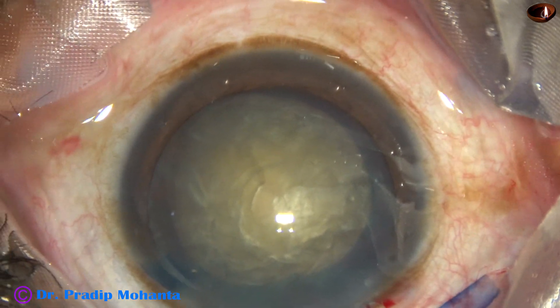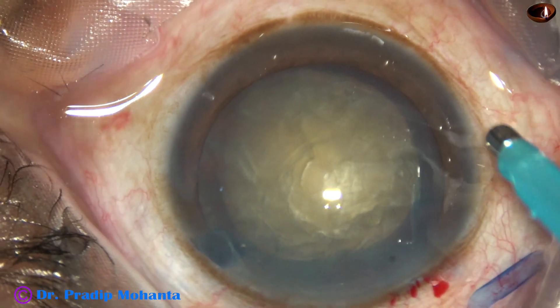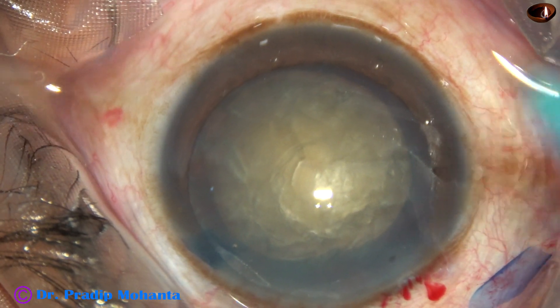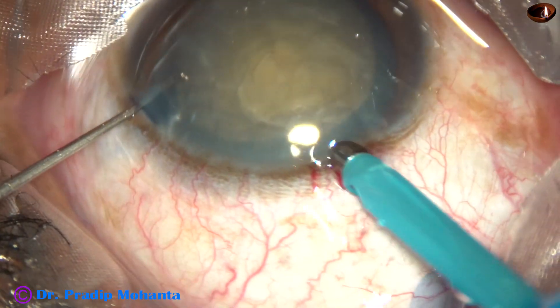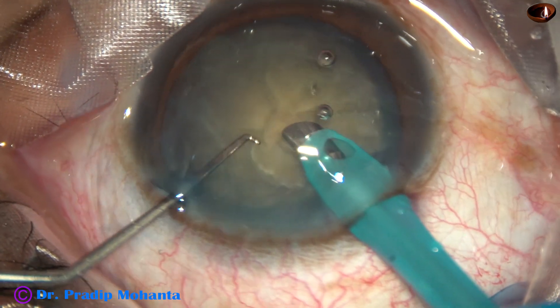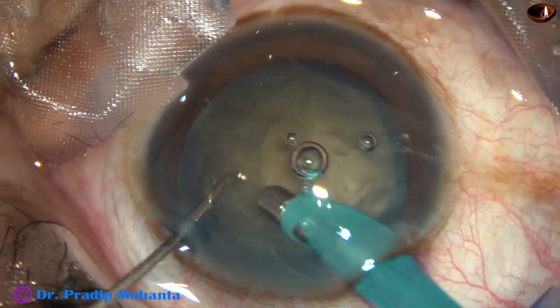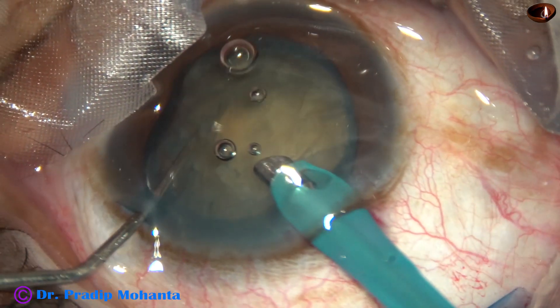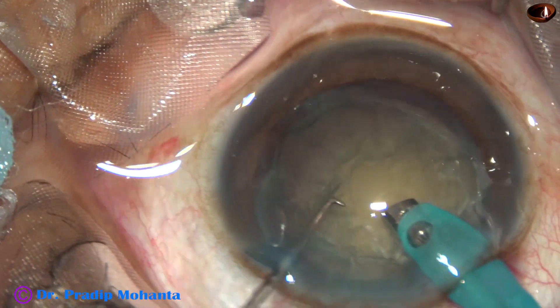Visco is again injected and now is the time to introduce the tip of the FACO needle. The machine being used is Faros from Oertli, Switzerland. I am in FACO 2 mode from the very beginning, and this is the technique I am going to employ.